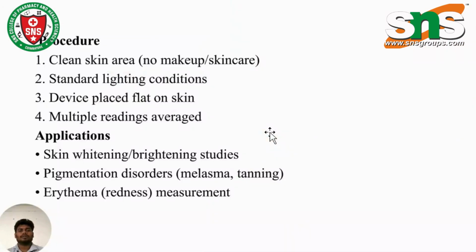And then moving to the procedure. A clean skin area, a standard skin color device placed on the skin, and then multiple readings averaged. Applications: skin whitening and brightening studies, pigmentation disorders like melasma, and tanning. Melasma and tanning are skin coloring in our human body.